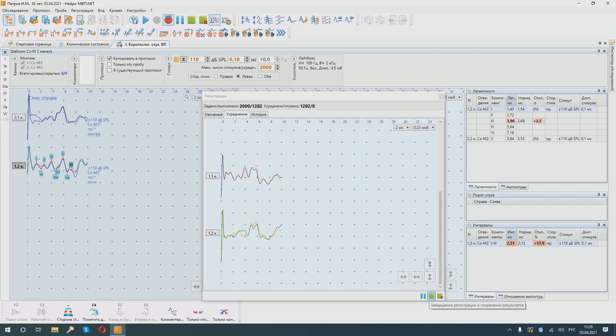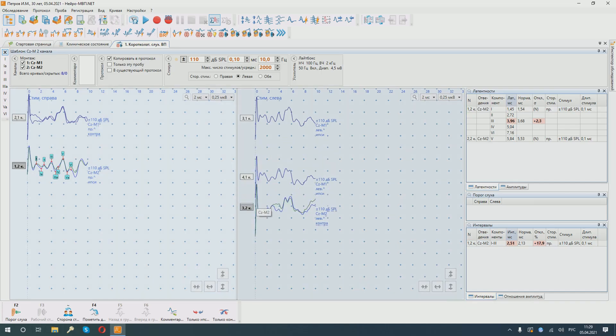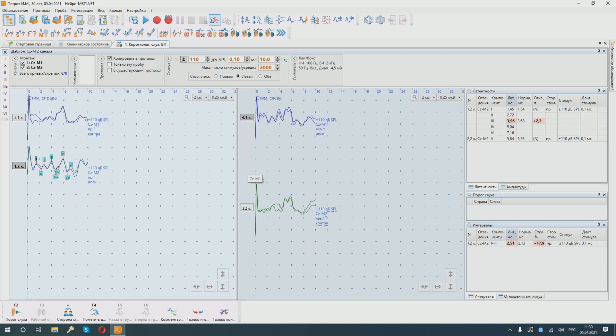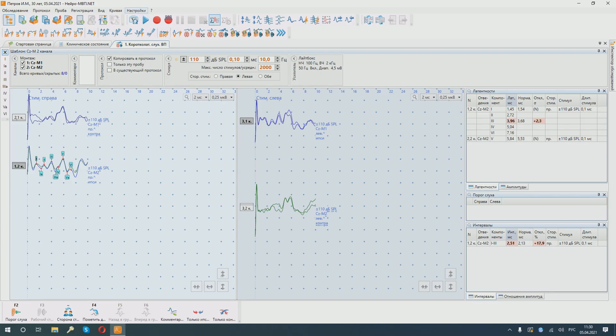We stop the stimulation, and we see that we have both curves on the contra side and curves on the ipsy side, in this case recorded on the first channel. We see good reproducibility from the first to the fourth peaks. There is a slight horizontal offset in the fifth peak.